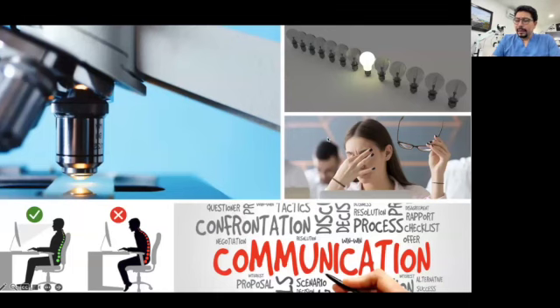So let's talk about why we need a microscope in our office. I can think about 5 main reasons. The first one is obvious, because of magnification. The microscope can go in different steps, and the range of magnification most of the time goes from 4.5x to 24x, with small variations because of the focusing distance and the magnification in the binoculars.